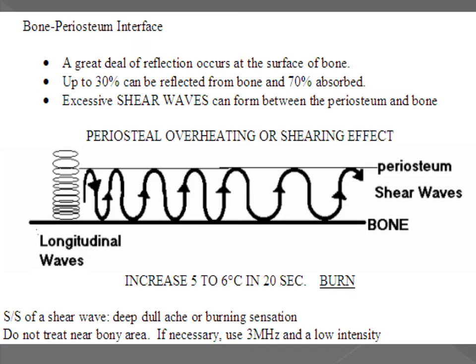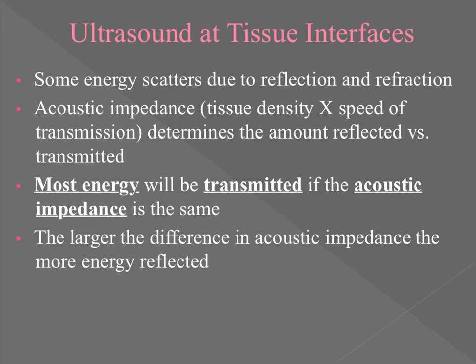The reason we want to move the ultrasound is because we're going to have some reflection. Regardless of how great the variables are when we start our treatment, we're going to have some reflection. We're going to have waves that scatter, waves that diverge, waves that reflect. But when we move that ultrasound head, we reduce the reality that the waves might reflect off of one another and collide and cause an increase in energy, right? I hope that I'm not scaring you away from using ultrasound. What I'm saying is make sure you keep the ultrasound head going.